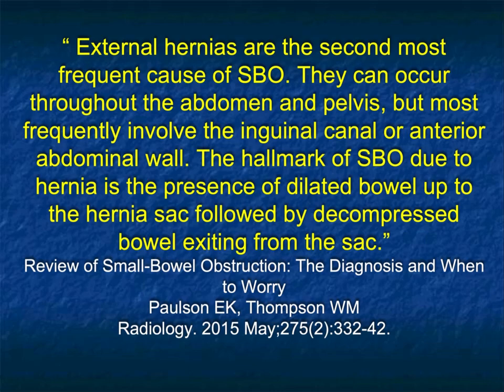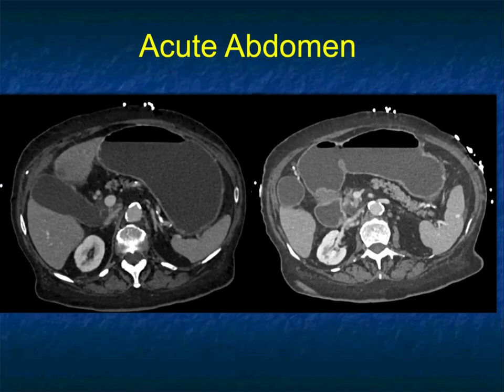External hernias are the second most frequent cause of small bowel obstruction. They can occur throughout the abdomen and pelvis, but most frequently involve the inguinal region or anterior abdominal wall. The hallmark of small bowel obstruction due to hernia is the presence of dilated bowel up to the hernia sac, followed by decompressed bowel exiting from the sac.